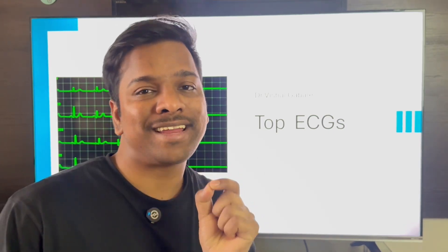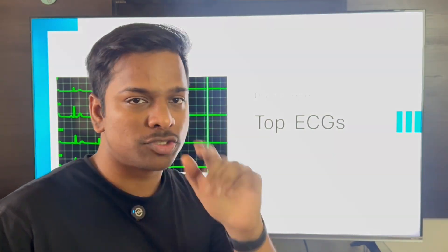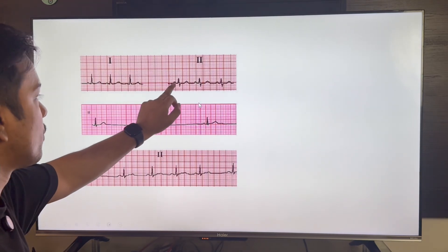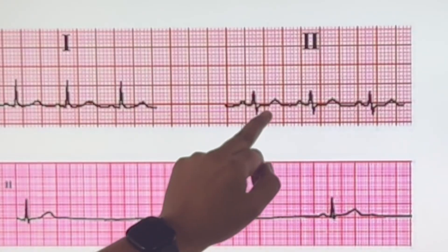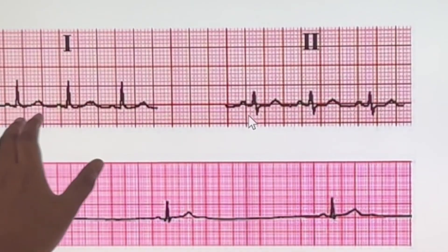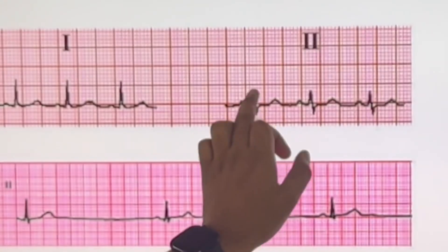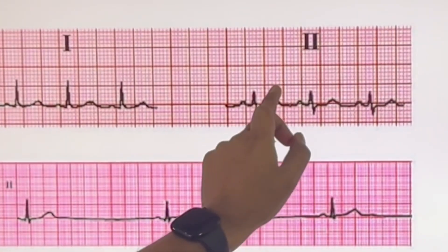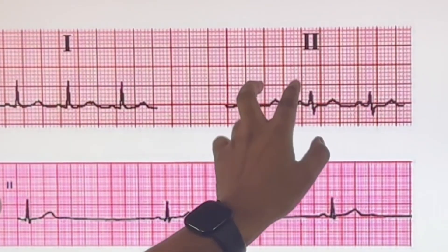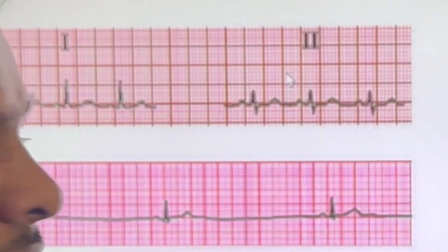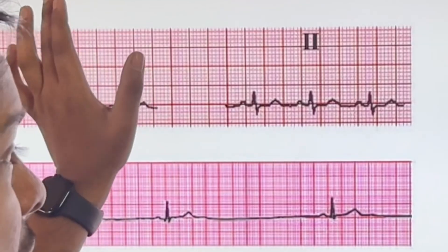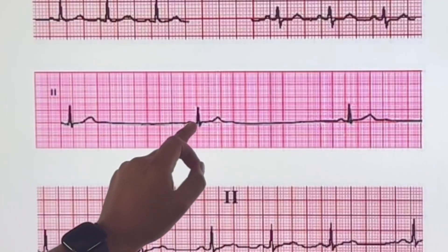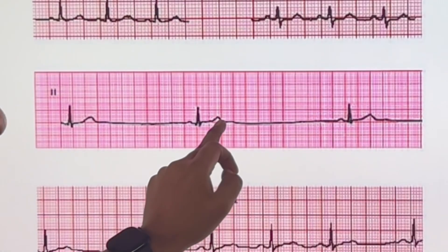Welcome to the top 10 ECGs discussion. In the first ECG, we can see P wave, QRS complex, and ST segment are present. The number of big boxes between two RR waves is about two and a half to three, so 300 divided by 3 gives close to 100. That means this has to be normal sinus rhythm.